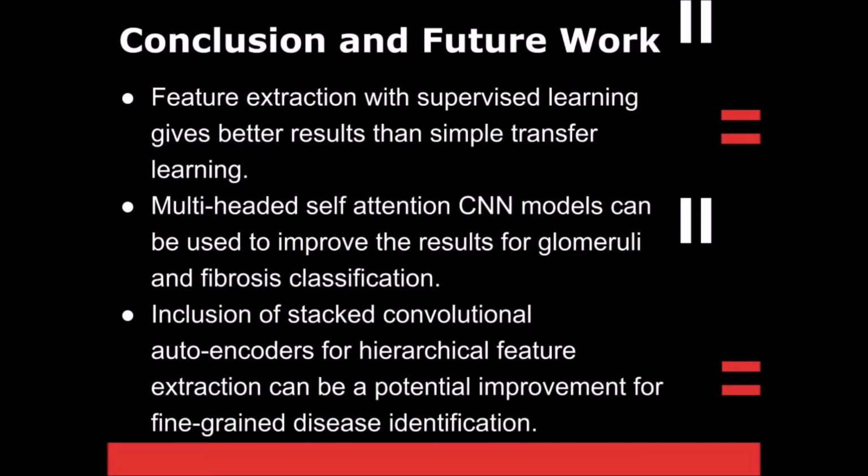To conclude, feature extraction with supervised learning gives better results than simple transfer learning. Multi-headed self-attention CNN models can be used to improve the results for both the classifications.